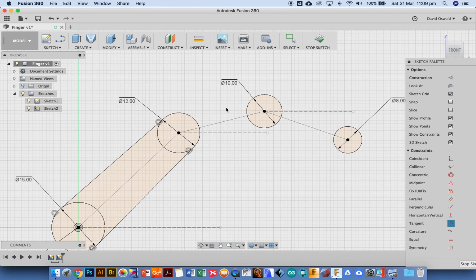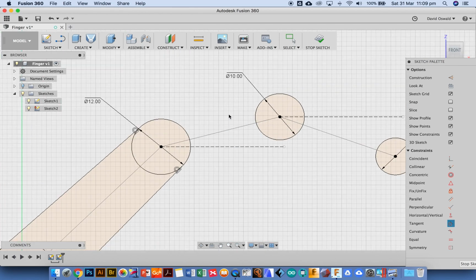Zoom out, zoom in on this next one. Click line. Click to click. Somewhere, it could be here, it could be here. Probably here is a better place. Again, it's already locked onto that by the look of it, but we'll just check. Okay, so I want a tangent between that one and that one. Tangent between that and that. Tangency between this line and this circle. There it is just there. And just to check, I'm going to go this line and this circle.